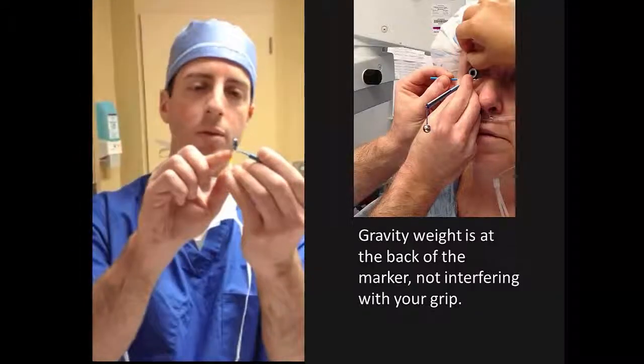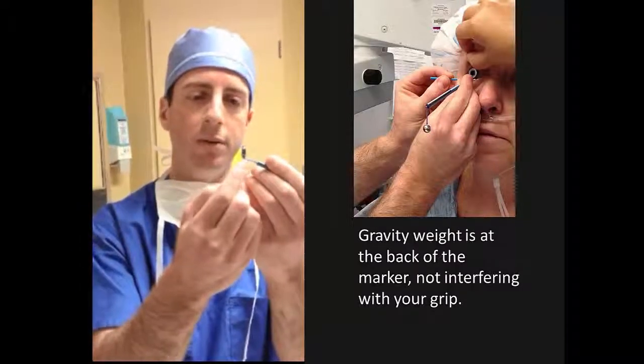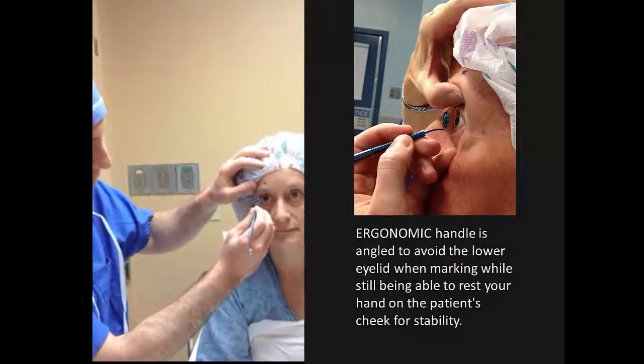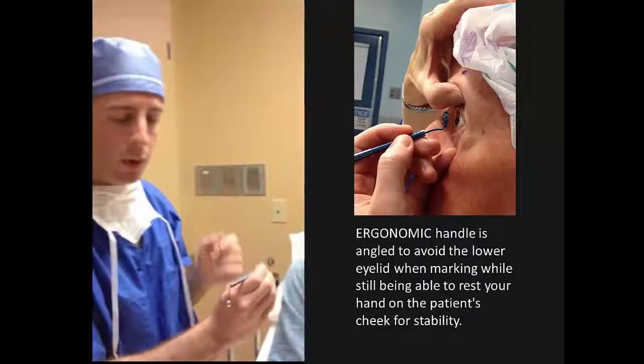The second modification was a change to the angulation that comes off the actual face of the marker. I used to have trouble when doing this — actually coming through and hitting the patient's lower eyelid — which I found quite challenging.